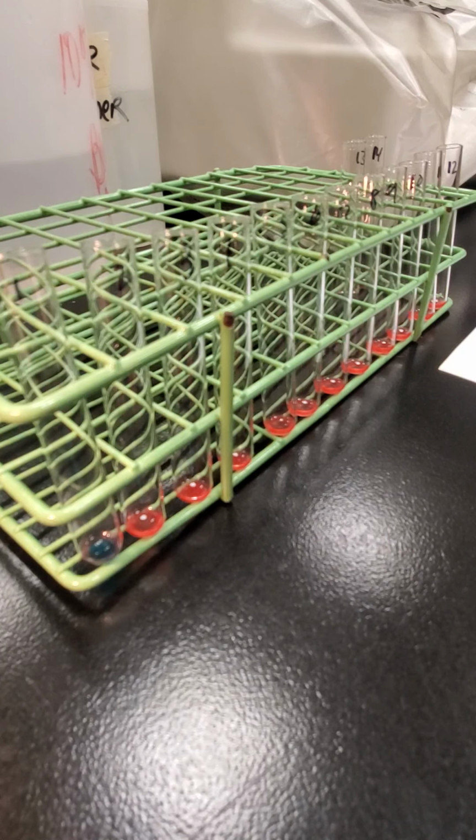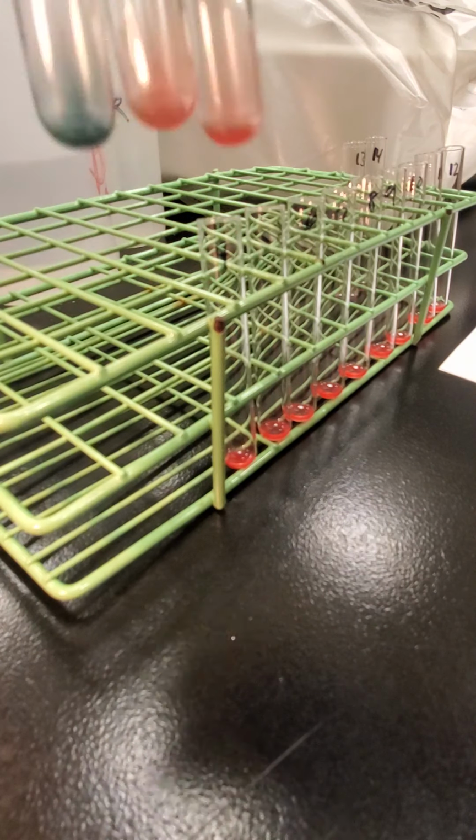So now I'm going to mix all the tubes and spin them for 15 seconds. So I'm just going to do 1 through 9 for the moment. Okay.